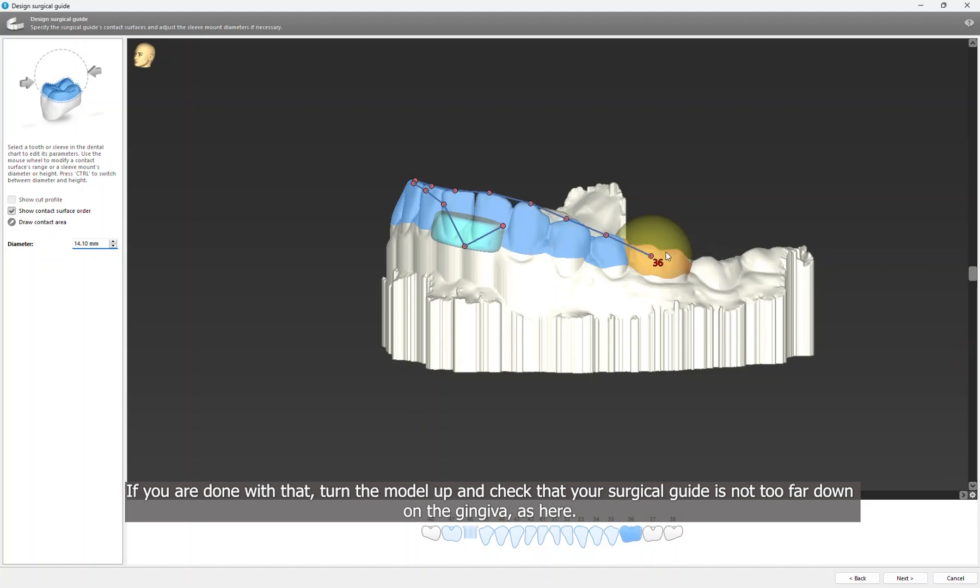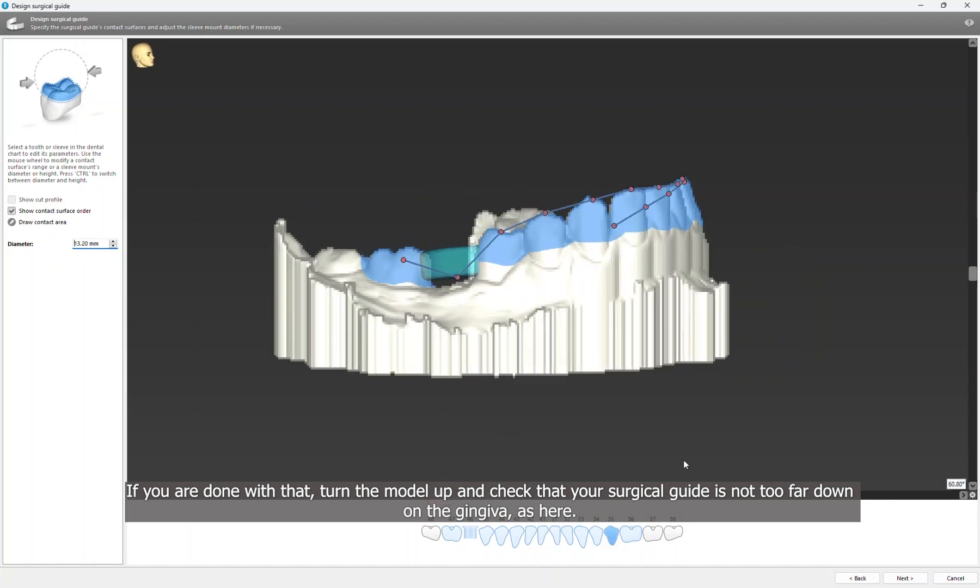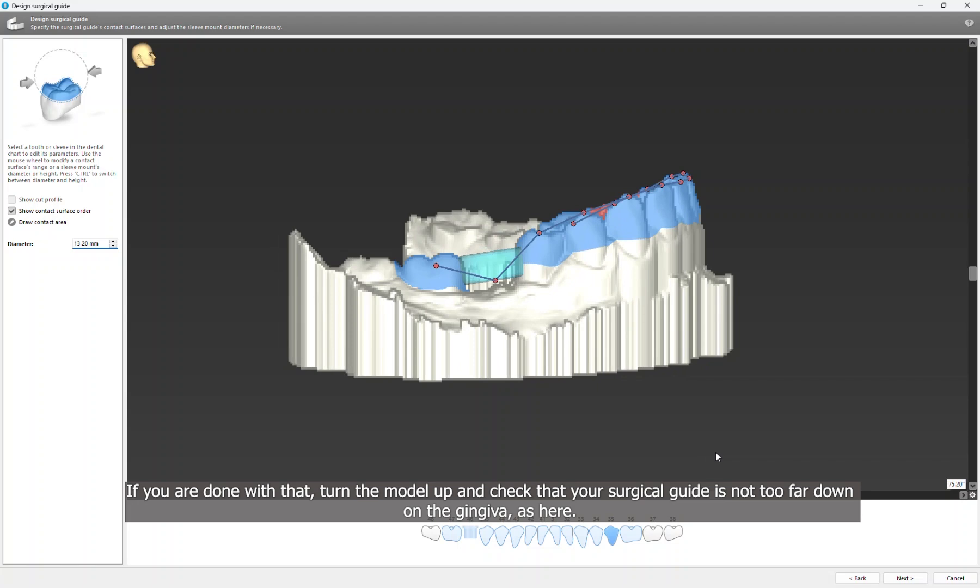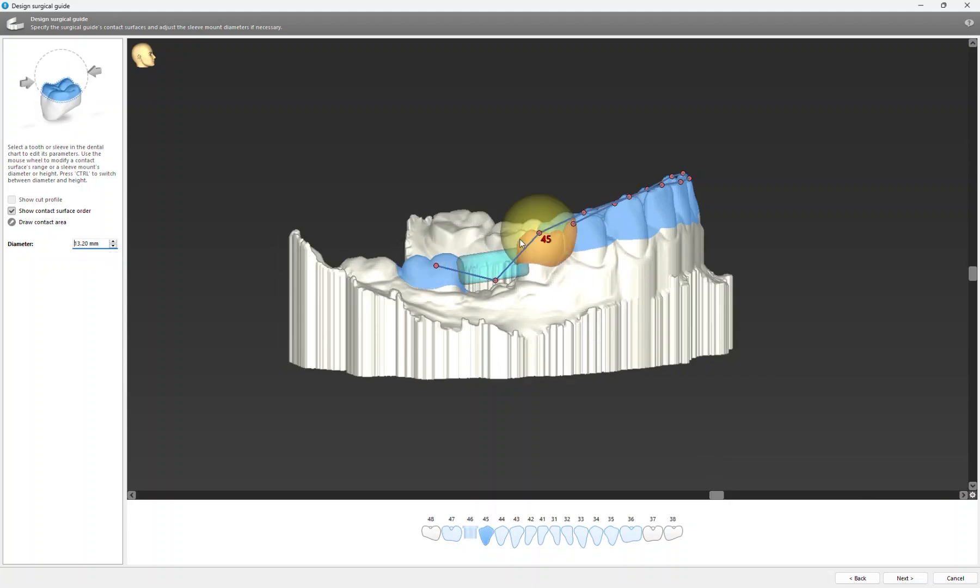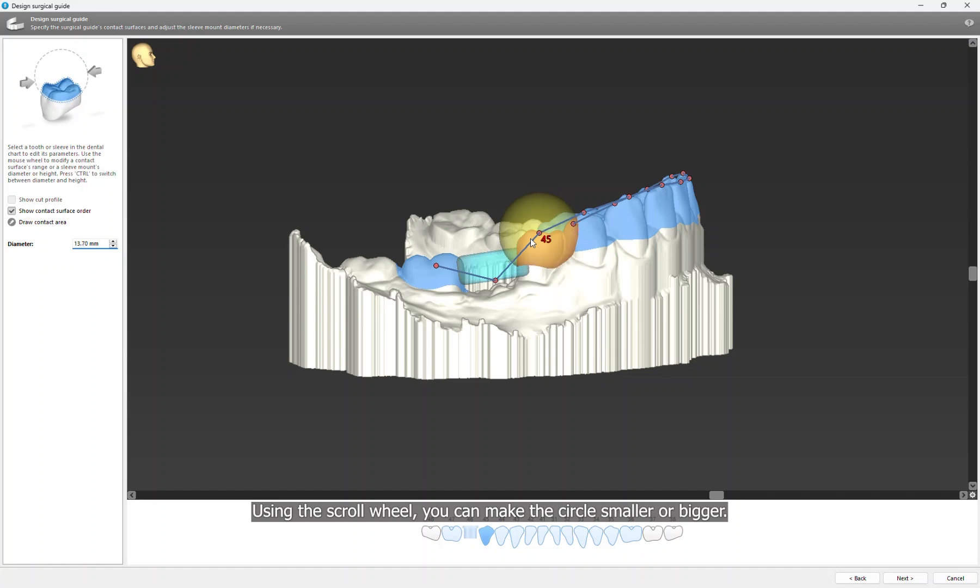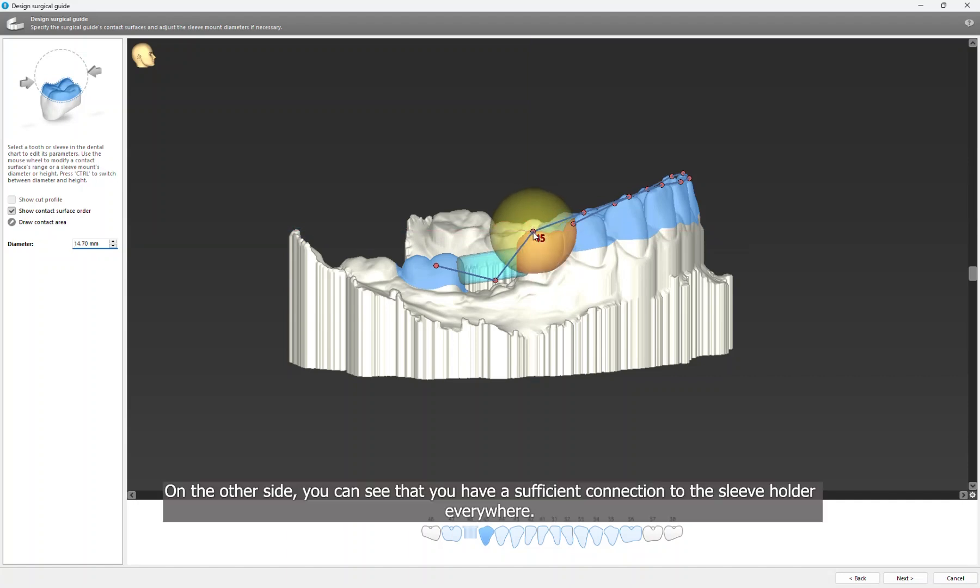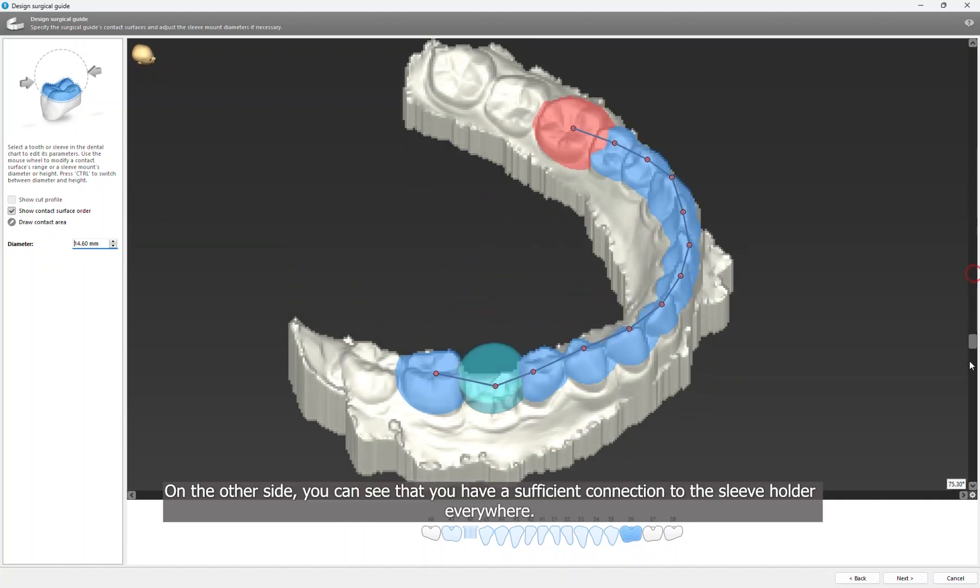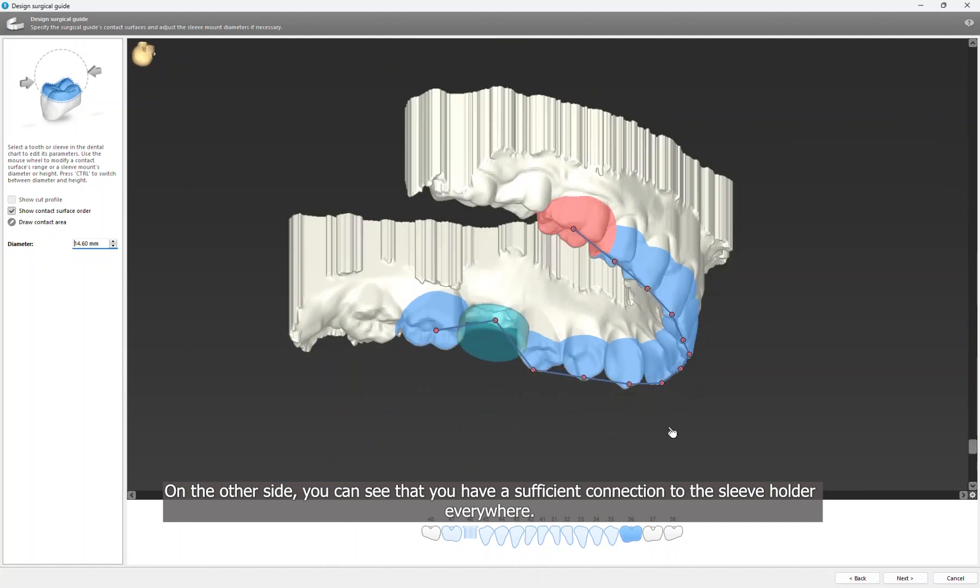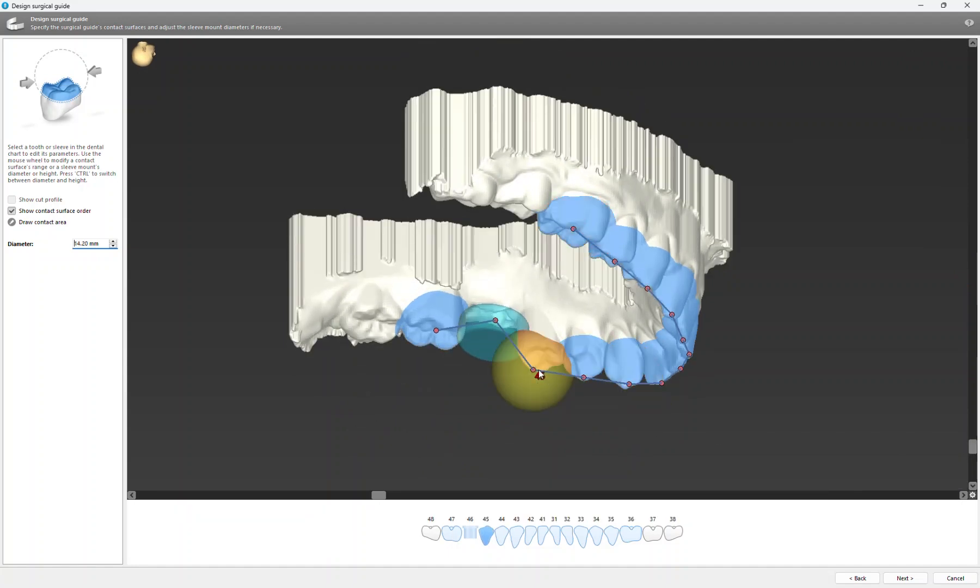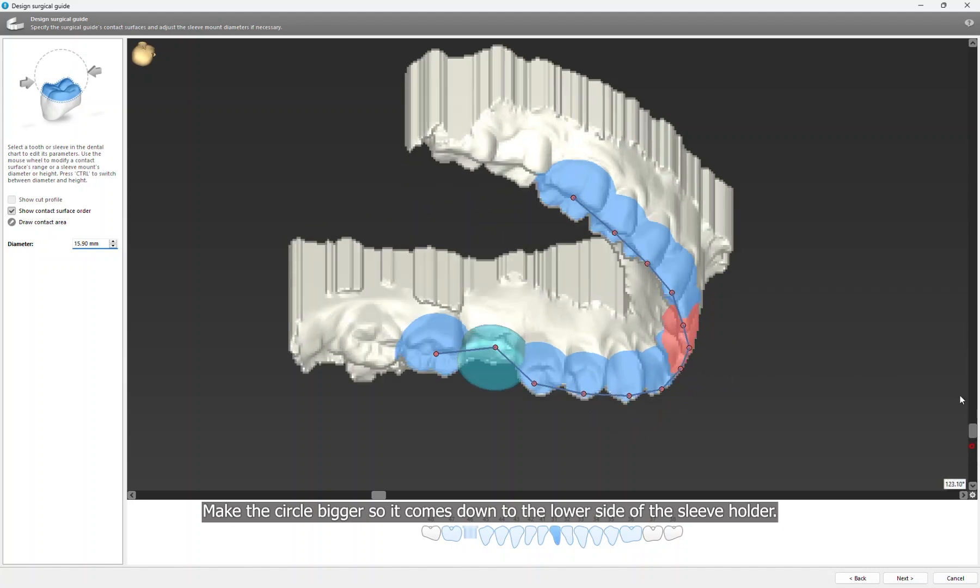If you're done with that, turn the model up and check that your surgical guide is not too far down on the gingiva, as here. Using the scroll wheel, you can make the circle smaller or bigger. On the other side, you can see that you have a sufficient connection to the sleeve holder everywhere. Make the circle bigger so it comes down to the lower side of the sleeve holder.